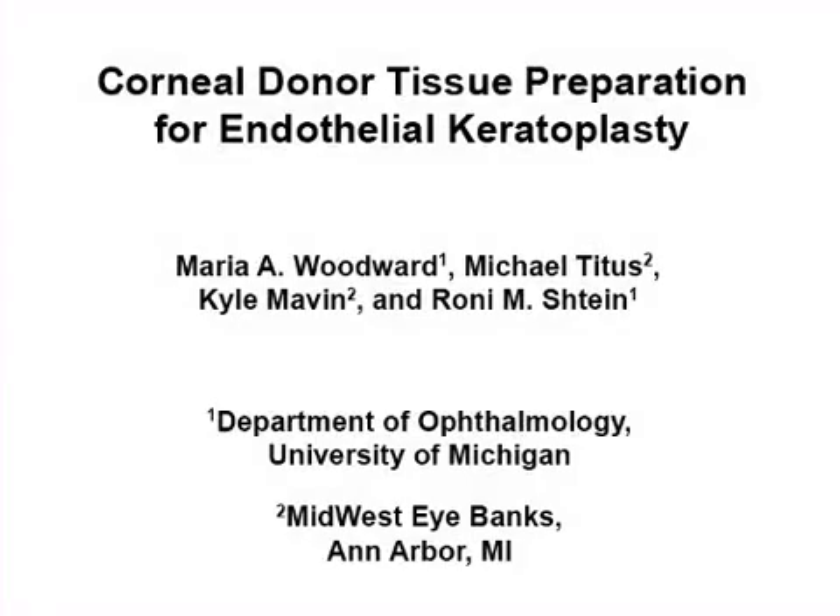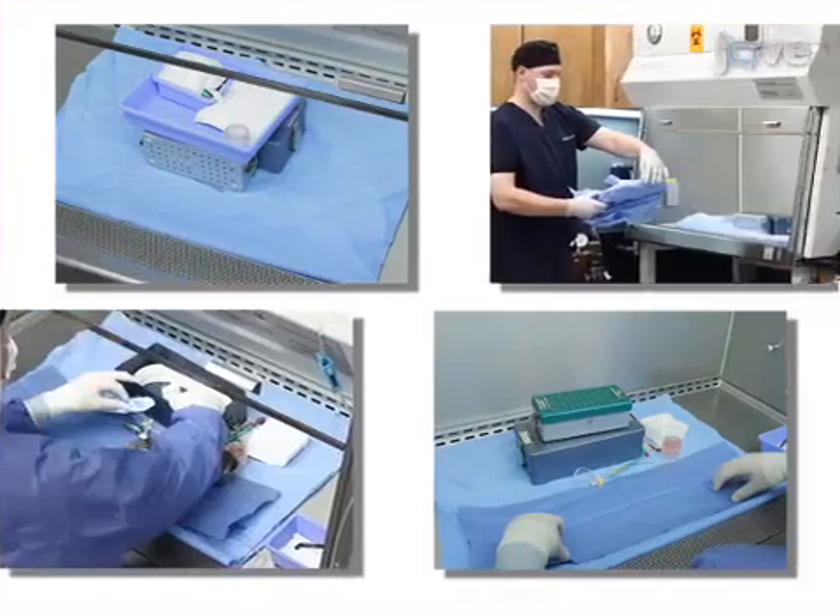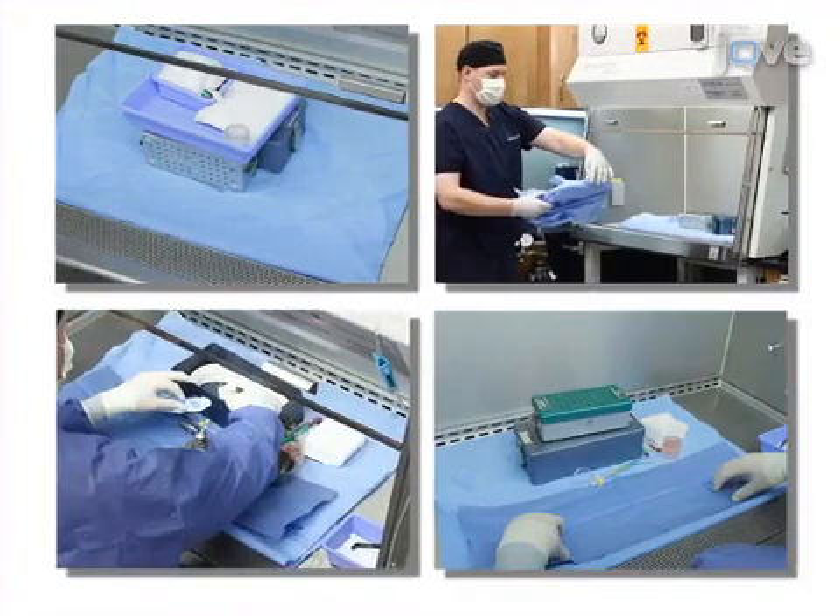The overall goal of this procedure is to consistently produce lamellar corneal graft tissue that is suitable for transplant. This is accomplished by first establishing a sterile field in the laminar flow hood.